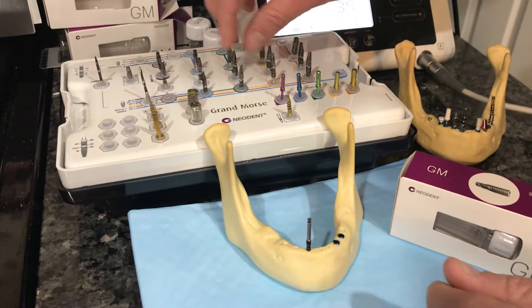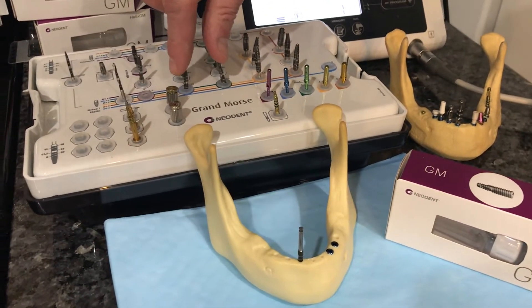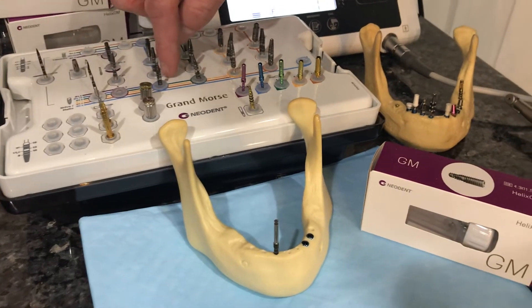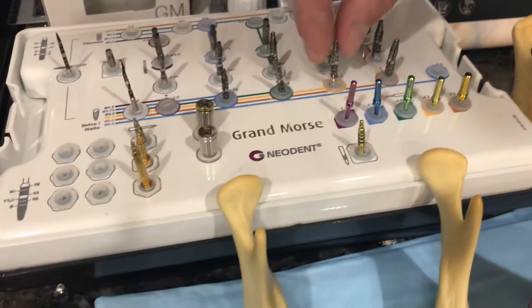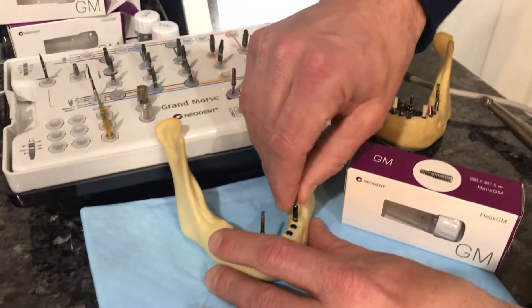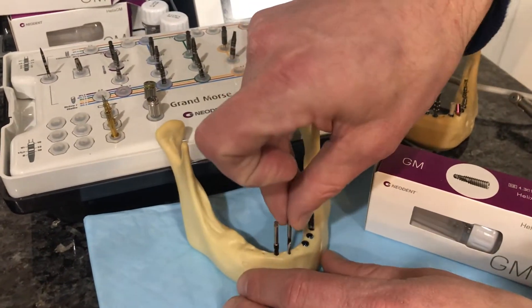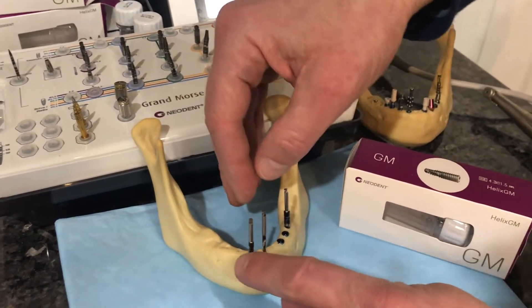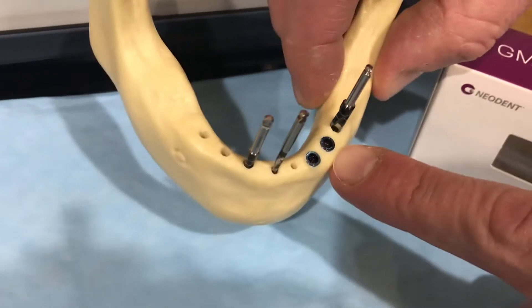As I widen the osteotomy a little more, I skip the next two drills — the 3.75 and 4.0. These are convenient sizes only, and I don't need them because I'm going up to a 4.3. So the typical drilling sequence is 2.0, 3.5, 4.3, and then we're ready to place our implant.